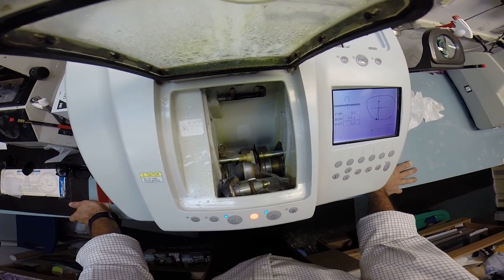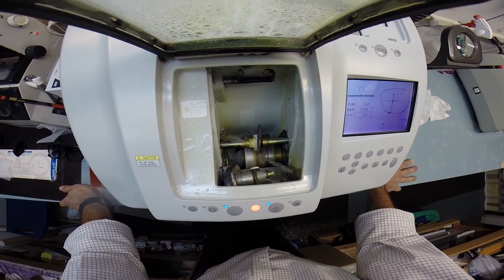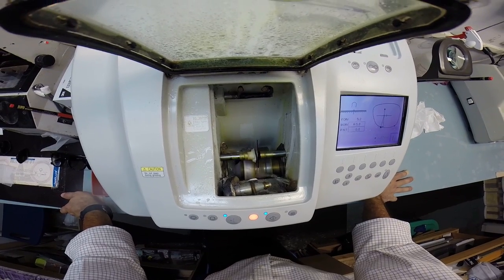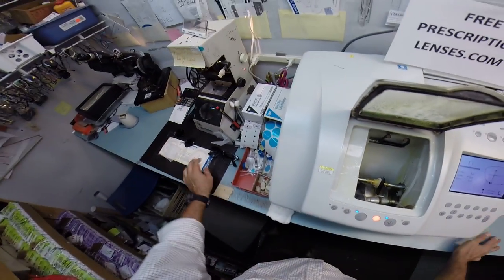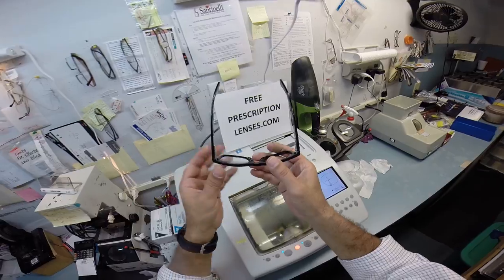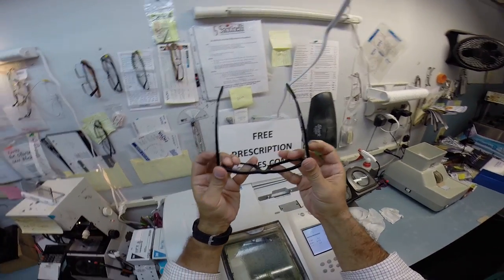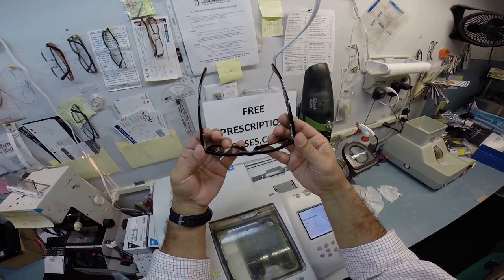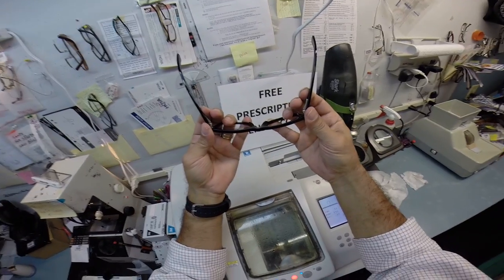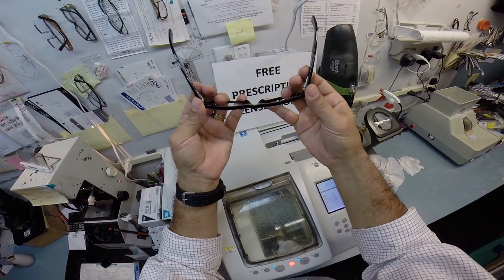So now the lens is getting the bevel put on there. And as soon as it comes out, we'll see if it fits. Actually, I can tell these have not been used because the one problem, the reason why they quit putting the spring hinges in is that it would flare outward for no apparent reason. It would just get loose.